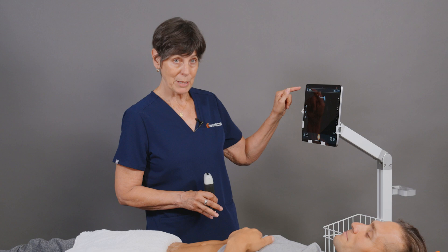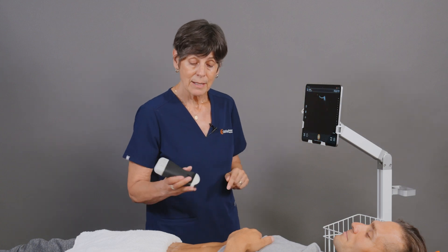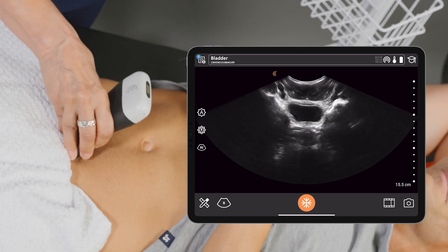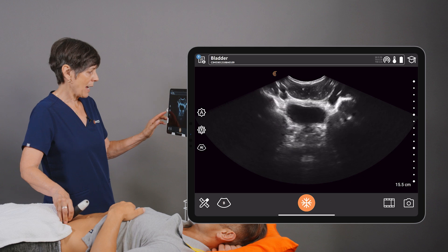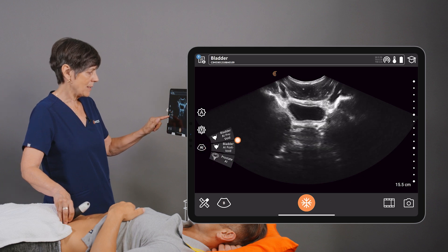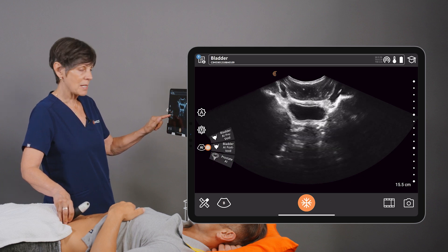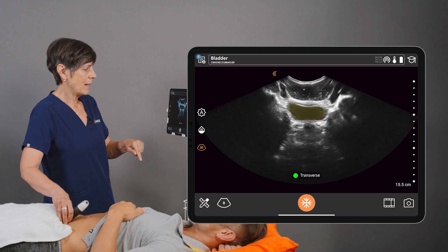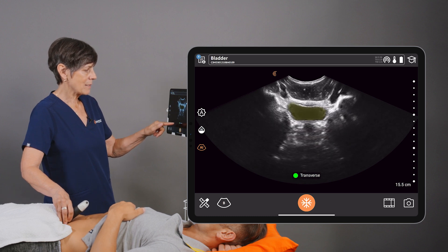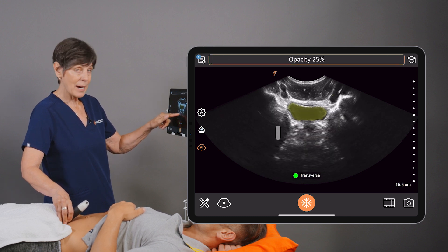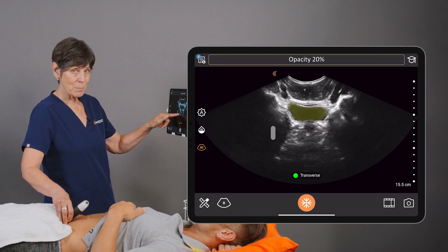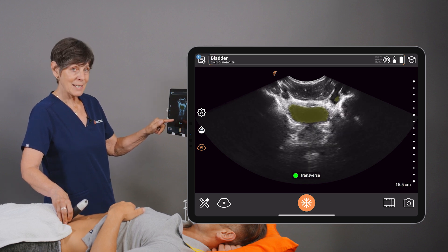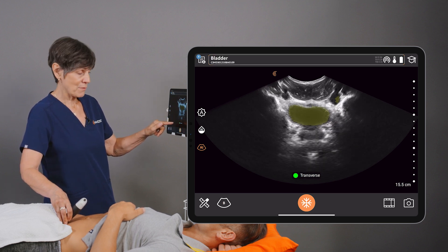I'm using the bladder preset and I'm going to place my scanner and point it down towards his feet. We can activate the AI and this time we'll choose the post-void option. Right away we can see that the segmentation mask is highlighting our much smaller bladder at this time, and it's recognized this as the transverse view.